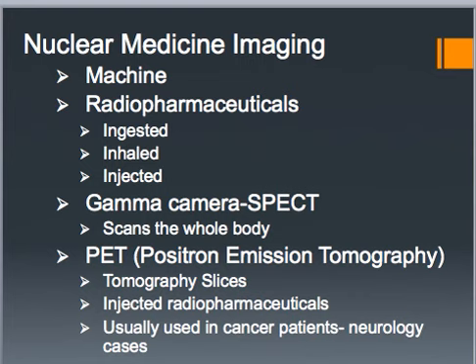So the difference between nuke med compared to other imaging modalities is that nuclear medicine focuses on the processes within the body. For example, it's looking at the rate of metabolism or levels of other various chemical activity. Where there are areas of greater intensity inside the body, those are called hot spots.